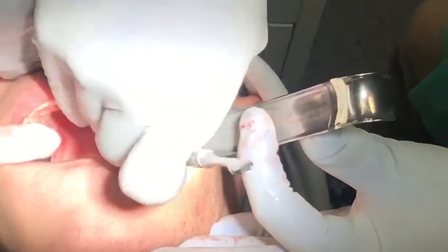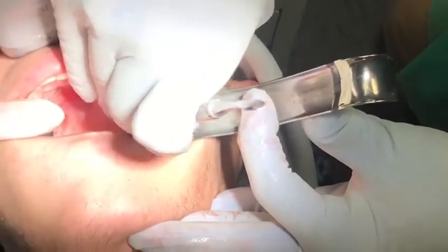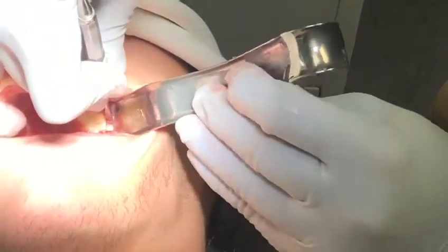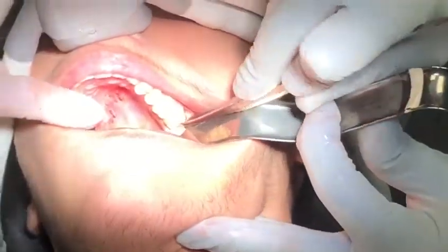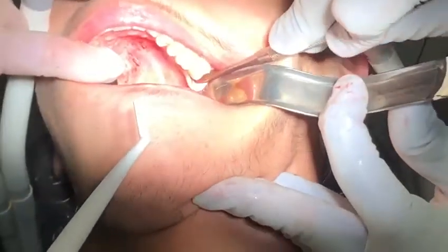So we can see a tooth — there you go. Hey, there it is. Yeah, we see it. Open big, and pressure, lots of pushing in this area.